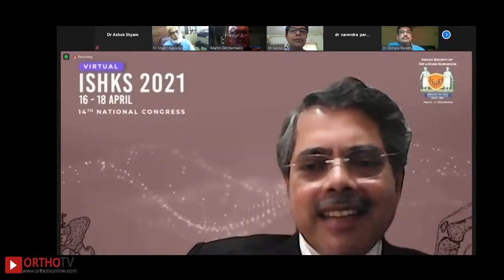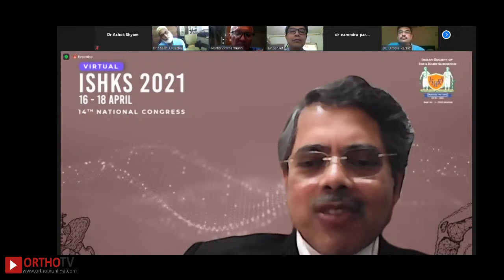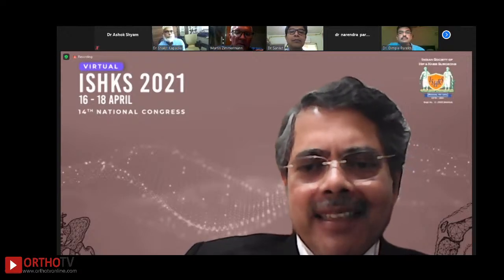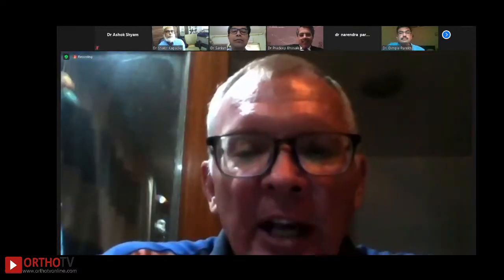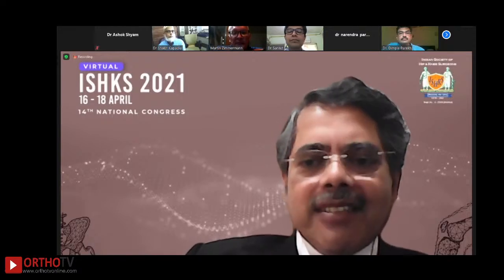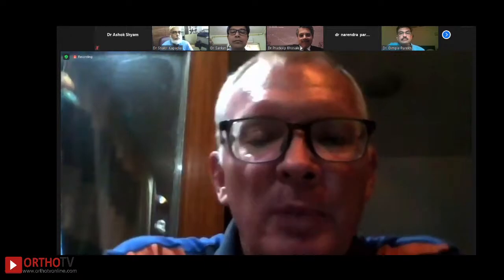And one last question. For the largest head sizes, 36 and higher, there is not much difference. So the optimum size is 36, and we should not go more than 36. What is your opinion? You mean in regard to dislocation? All the aspects: dislocation and other issues, also trunnion issues. So I would answer this way, for a traditional total hip arthroplasty.